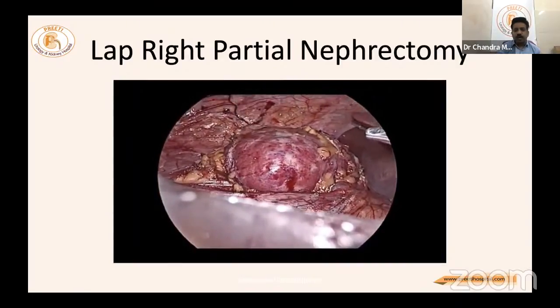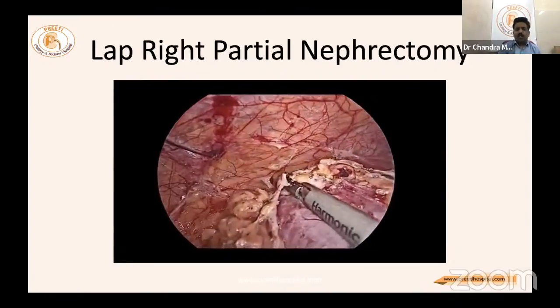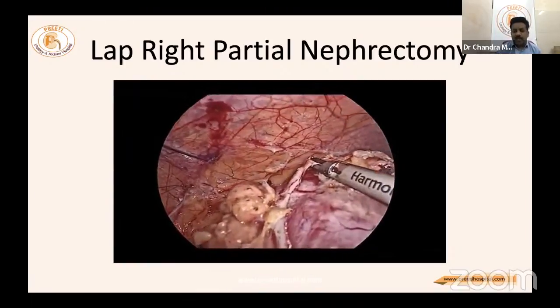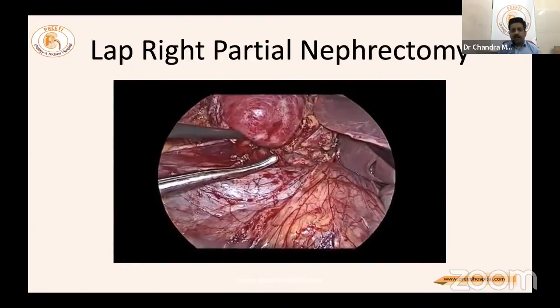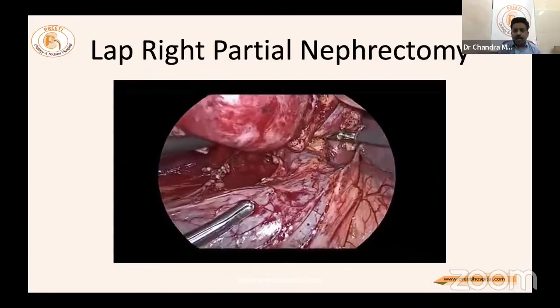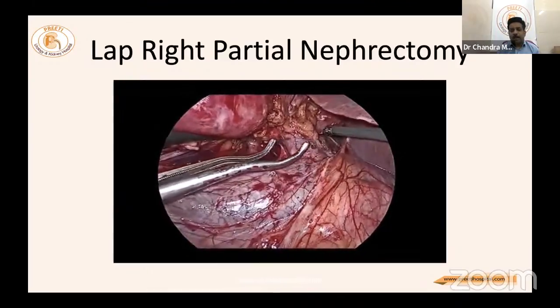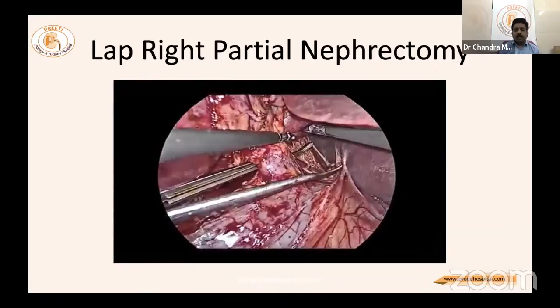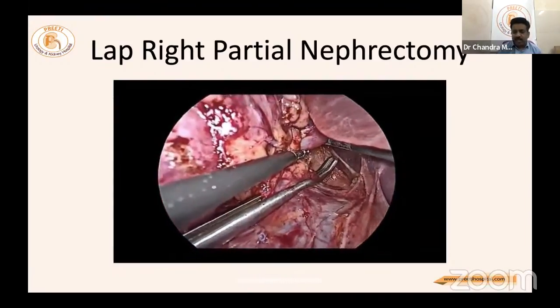The kidney with the lower pole tumor on the right side is positioned — one person lifting. Separating all fat as in partial nephrectomy: Gerota's fascia violation is expected, but do not remove fat from directly over the tumor. The Satinsky clamp is applied — sometimes suturing is not needed; lift both upper and lower poles and apply Satinsky carefully so the IVC is not trapped. This step must be done slowly — 30 to 40 seconds does not make a difference. Moving slower actually results in less warm ischemia time.